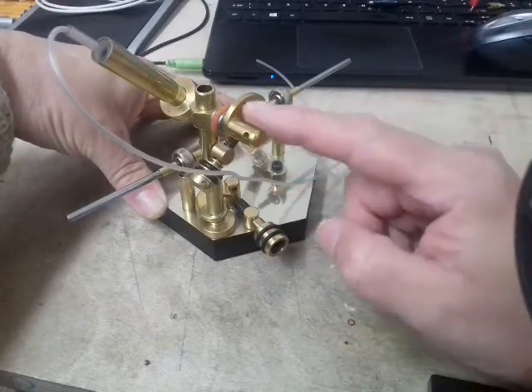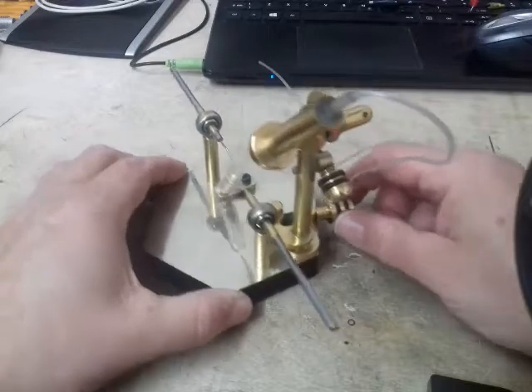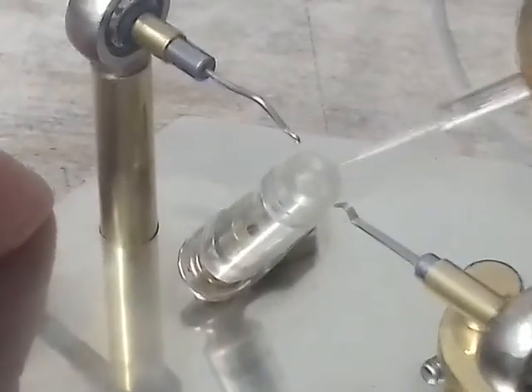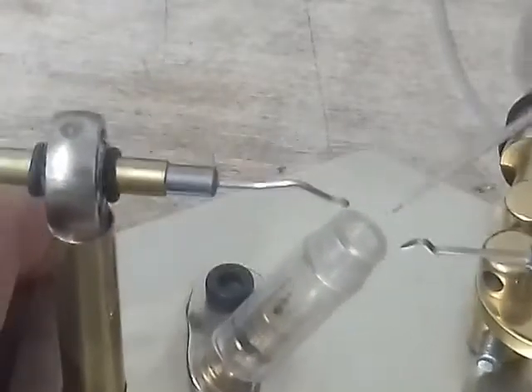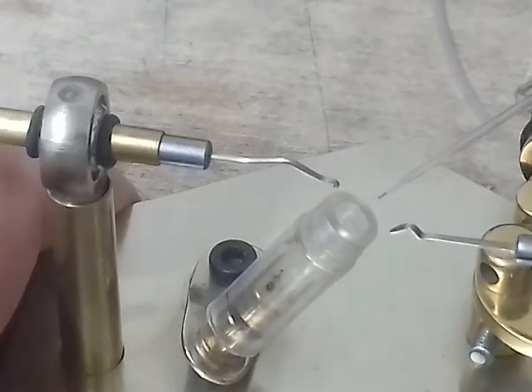It's got two inch levers, one at the top here and one at the bottom here. And if I zoom in on the needle and just show you how fine it can be manipulated. That's the infeed, done by hand, which is very accurate, and once you let go it stops, it stays tight, it doesn't move.